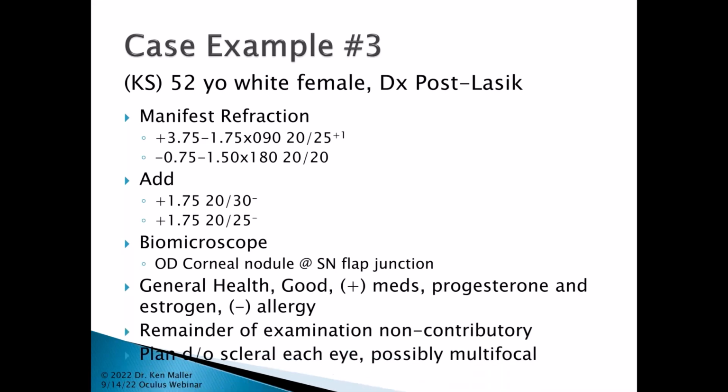So I plan to do a distance scleral lens on each eye with the thought, because she does so much close work, if we can get a multifocal in there, I'm going to do that as well. But first, since she had such a bad experience before, I said, let's just do a distance lens and see where we can go from there.